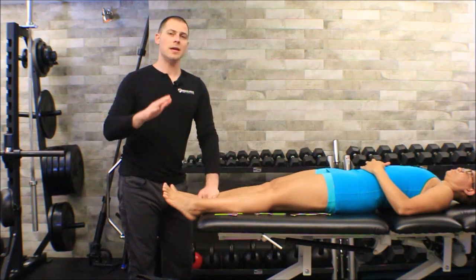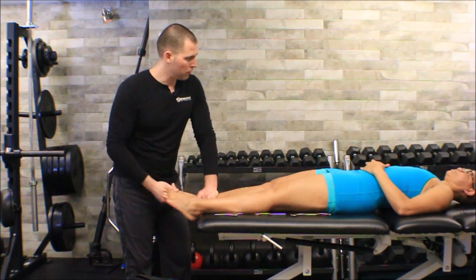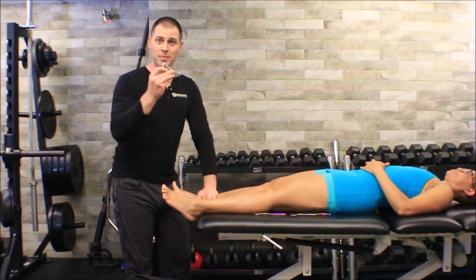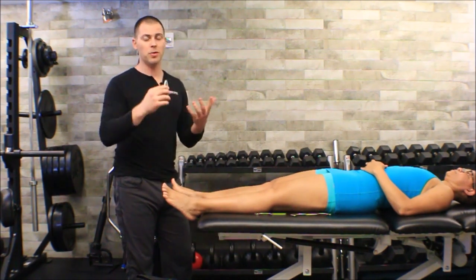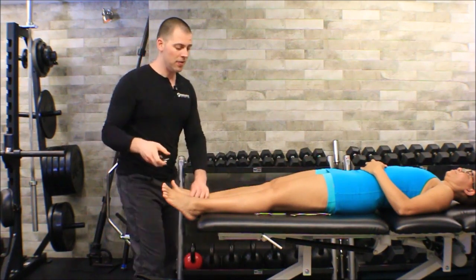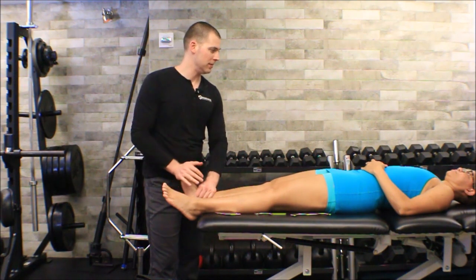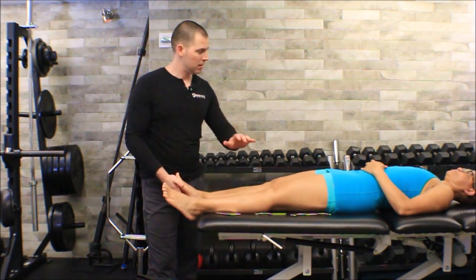All you're doing is basically going through nice long strokes through the plantar fascia. You guys can do some kind of cross friction with this tool. It is going to be very hard to go in a bunch of different directions, but we can get some with the cross friction. And then don't forget to add a little bit of these more active mobility techniques with the pin and stretch.